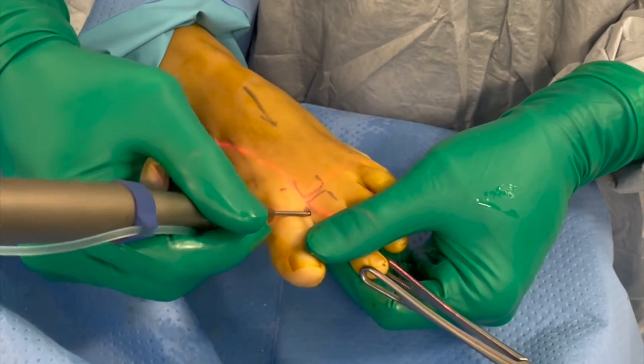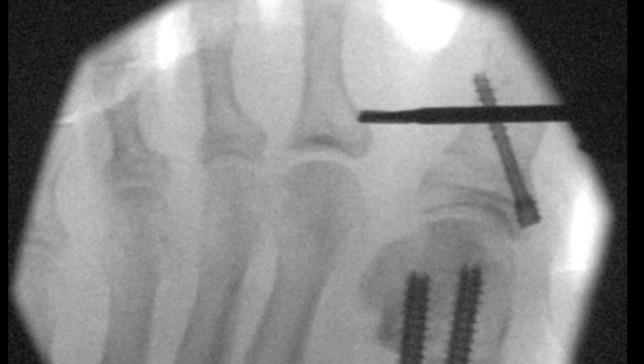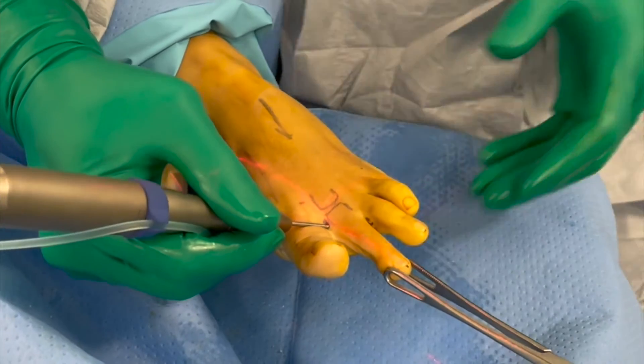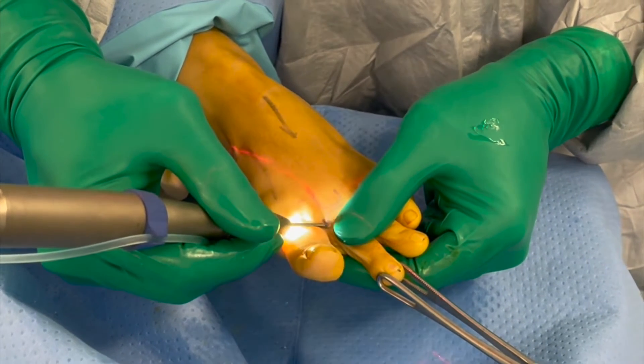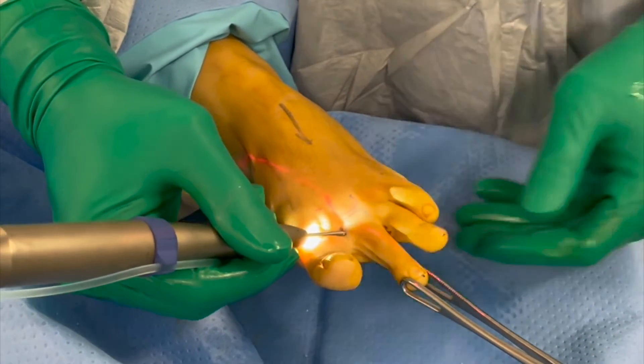An irrigated 2x8mm burr is set at low speed with high torque. The tip of the burr is positioned at the diaphyseal-metaphyseal junction at the base of the proximal phalanx just medial to the EHL tendon. This position is confirmed with the image intensifier.